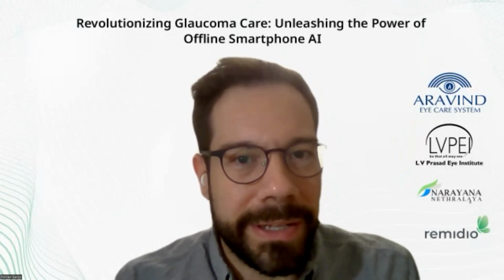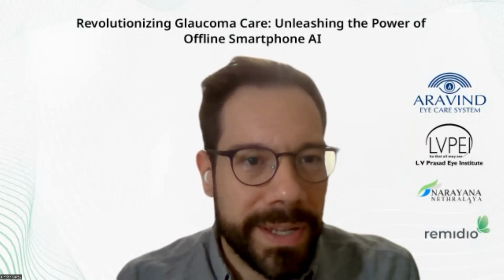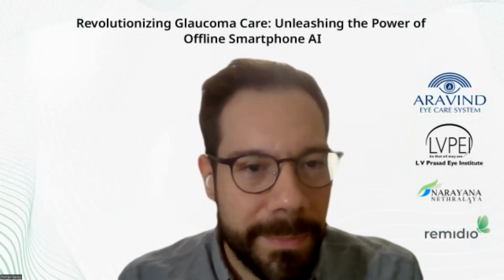Yeah. So does it mean that the AI tool now works only with the iPhone? Can we use any other model of phone, or can it work online as well? It can work online as well, as in a survey. It's actually always easier to deploy it online compared to offline. And on Android devices, nowadays, there are also ways to potentially deploy as well.